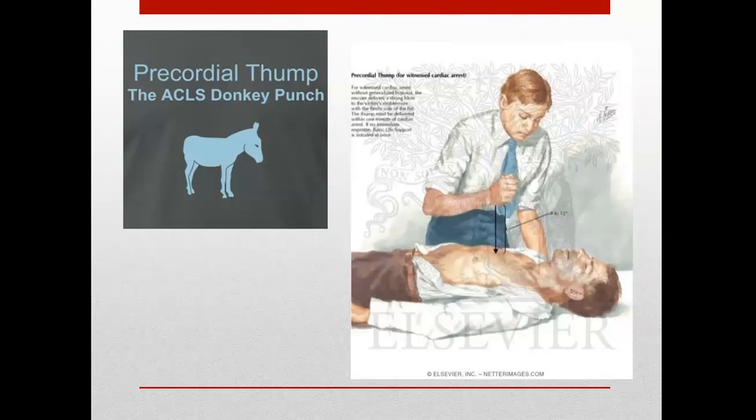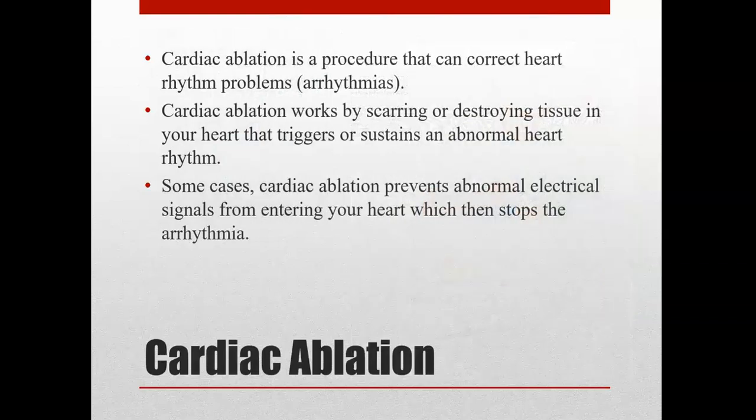And this is very much not recommended for pediatric patients just because they are so much more sensitive and their bodies are so much smaller than actual adults.